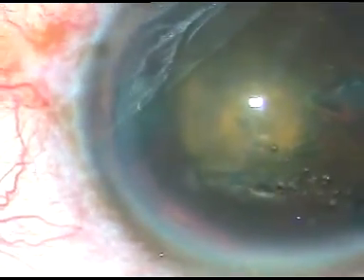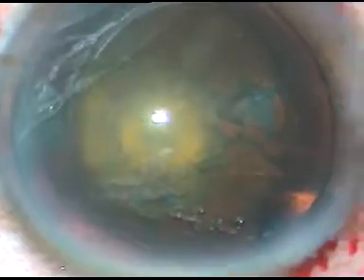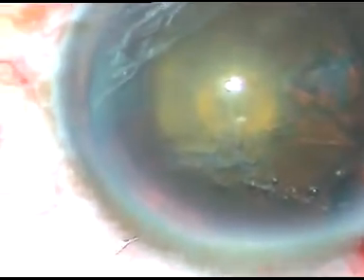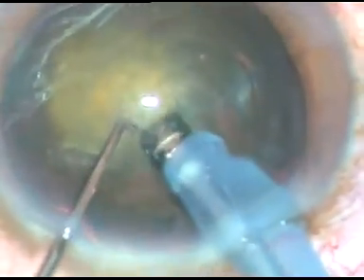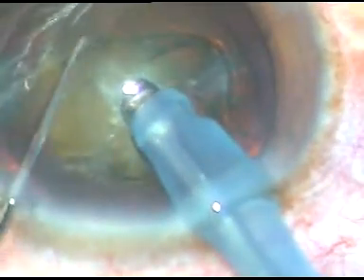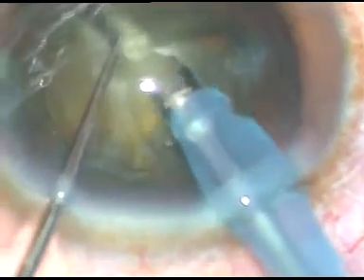The idea is to remove the nucleus when the epinucleus will be there. The epinucleus will act as a buffer and support the nucleus. Now, I am not going to rotate this. I am going to do as I do in no-hydro phaco, which I learned from Dr. Naran Bhartula of Jorhat. I have just divided the nucleus.